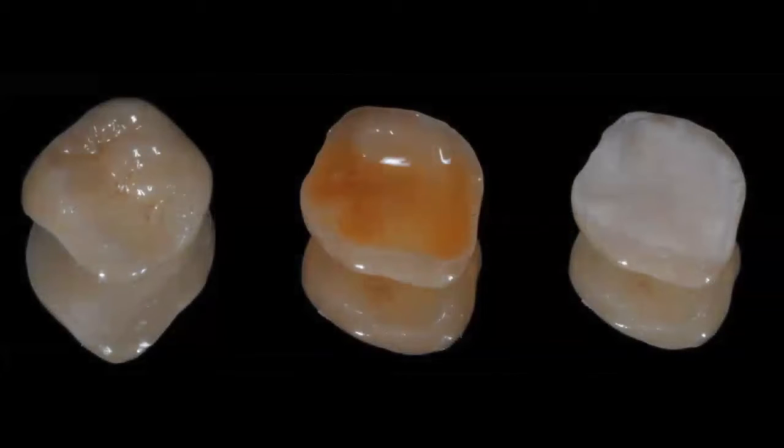There are two things I want to share with you. One of them is receiving your partial coverage or full coverage restorations in a glass ceramic that have not been etched by the lab. This is my preferred method. I like to ask my lab not to etch my ceramic restorations so that I have control in my practice over when and how to do this. These steps are very critical, and if they are not done correctly, they may create a problem in the long-term prognosis of your restoration.